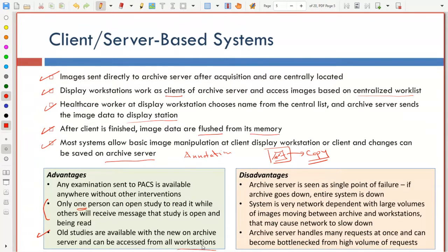Doctors sometimes, if they suspect something in the images, will look at the medical file of this patient. They would look if there is another study done by the same patient before, for example last year or the year before, so that they can compare whatever they see. For example, if a woman had a mammogram with some suspicious signs, the doctor would like to see how they looked before and how they look now, and detect whether it's going in the right direction or becoming worse, okay?